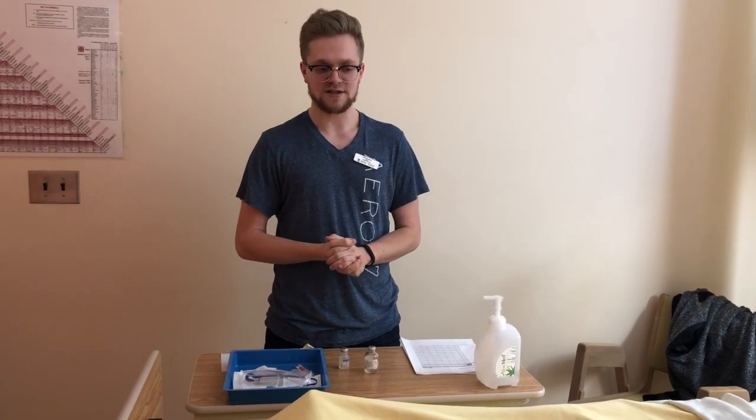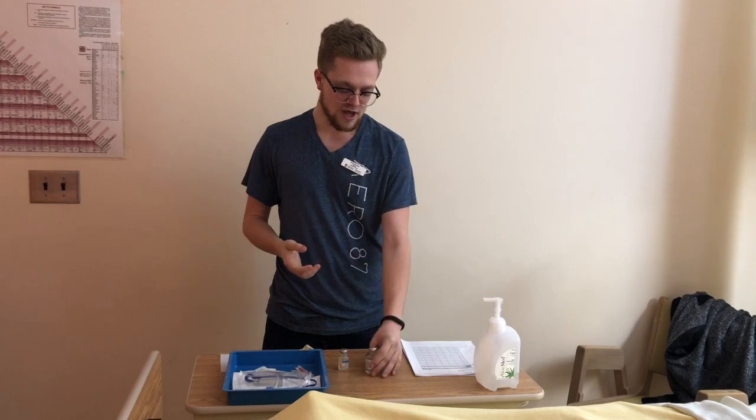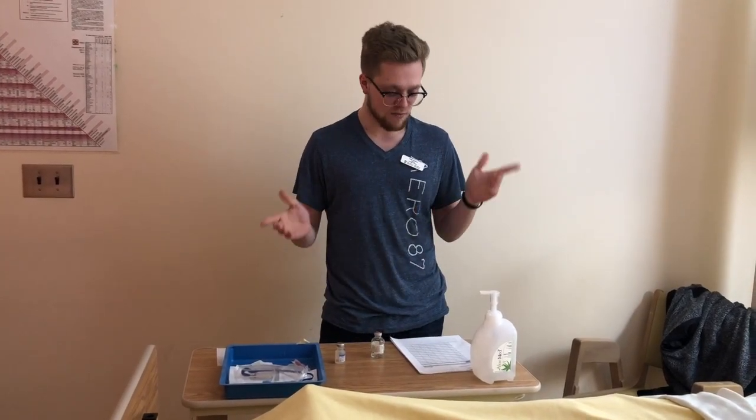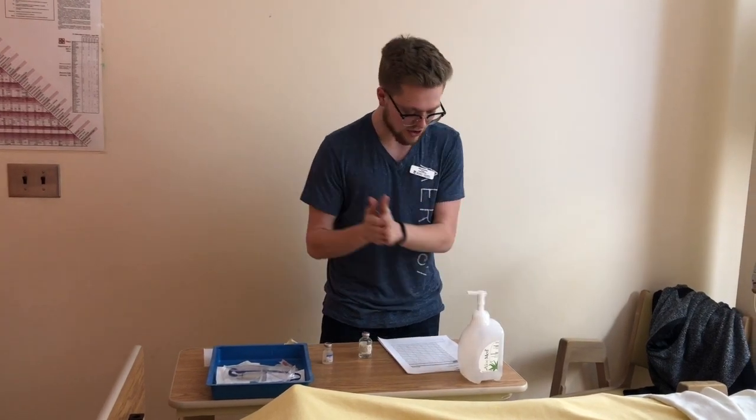I'm a student nurse, and today we're going to talk about the reconstitution and implementation of cloxacillin through IV piggyback. So let's get started. I'm going to do some hand hygiene here.